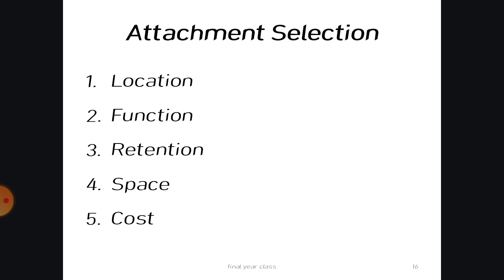If you want a hinge component of motion, some amount of hinge movement you are planning to give for your attachment, you can go for a class 3 attachment. So that is how you select your attachment. So based on function, you have the opportunity.